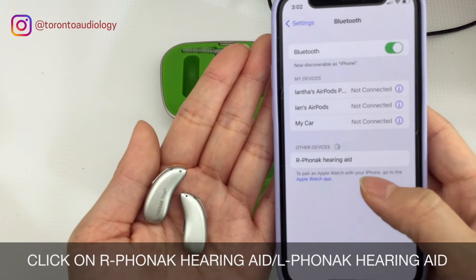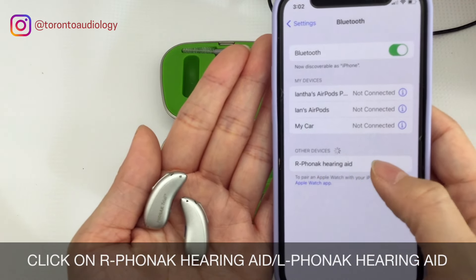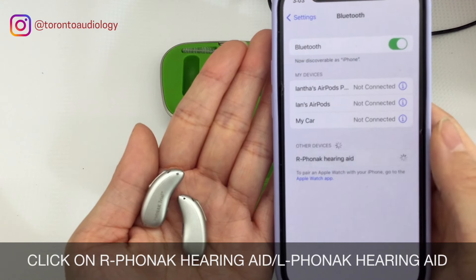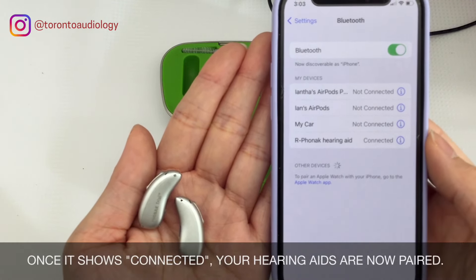Once the hearing aids have restarted, you'll see them appear on the screen showing your Phonak hearing aid. Click on that to pair it. Once it shows connected, your hearing aids are paired to your iPhone.